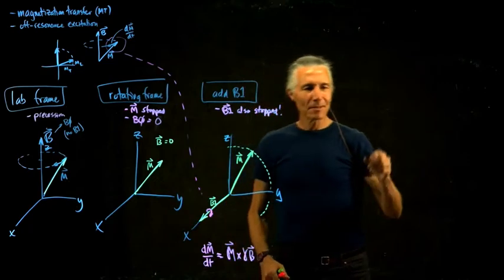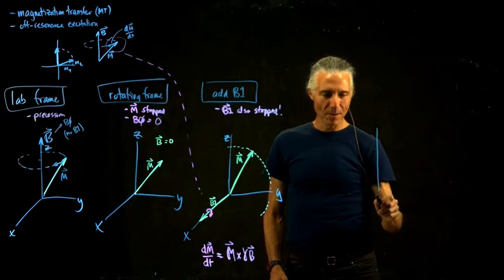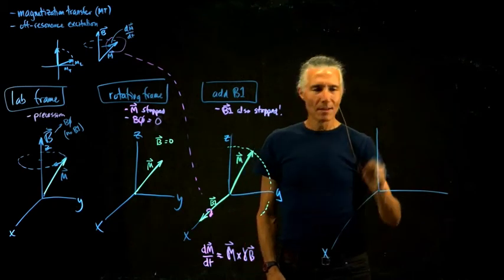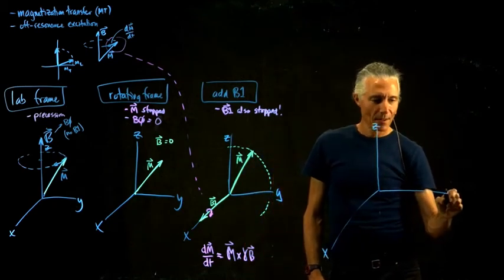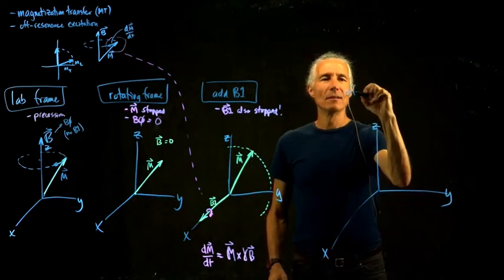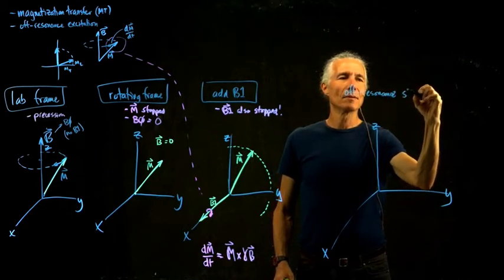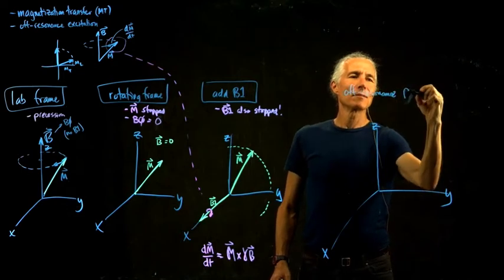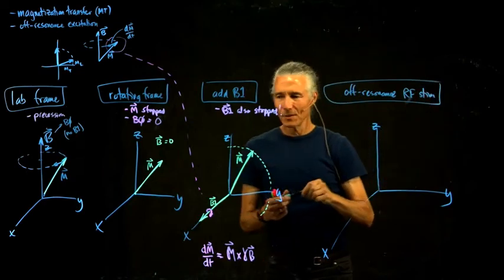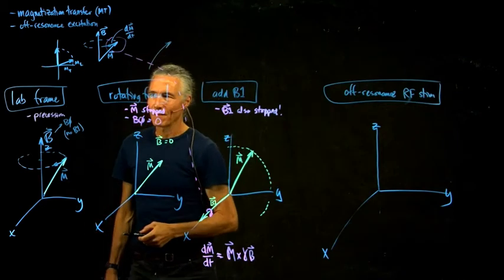So now it gets a little more complicated. There's more arrows. I'll draw it out here, and then I'll draw sort of above and below off-resonance in a second, but we'll just start with this. So what happens off-resonance with RF stim? What happens when we're off-resonance? First of all, let's just take one off here. What does off-resonance look like?